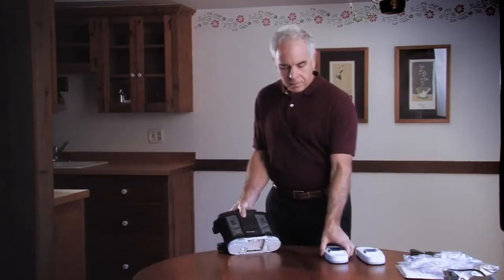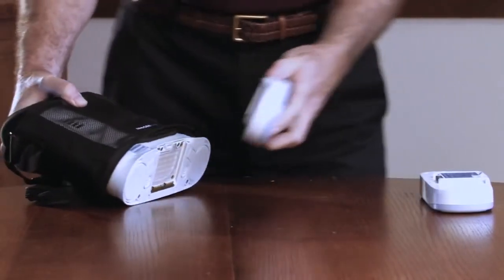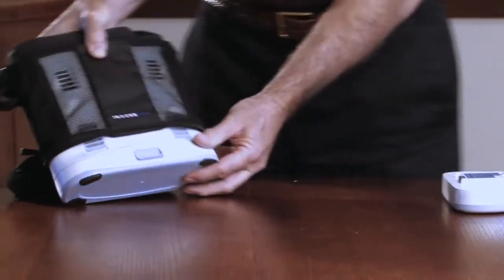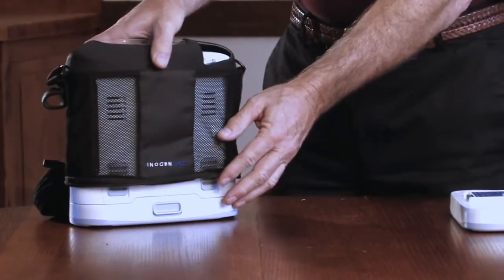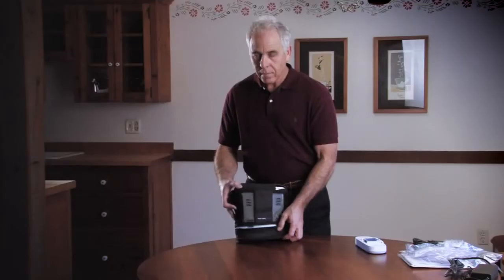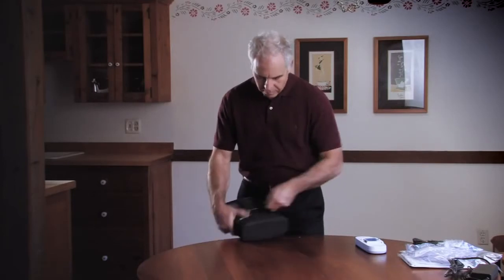Now, take one of the batteries and slide the battery into place at the bottom of the concentrator until the latch returns to the upper position. Now you can zip up the bottom of the carry bag.